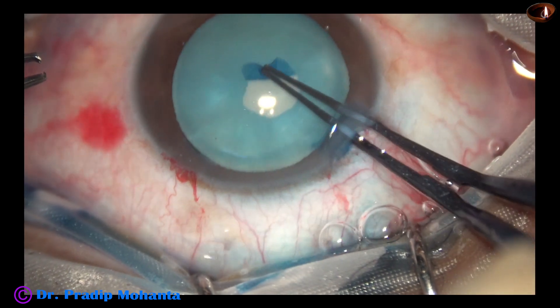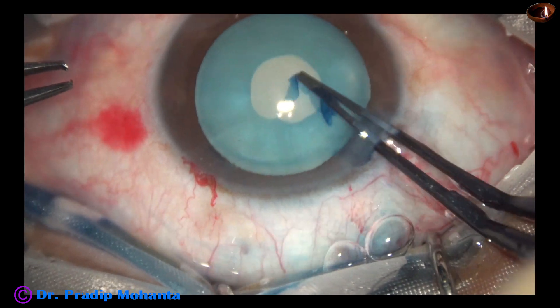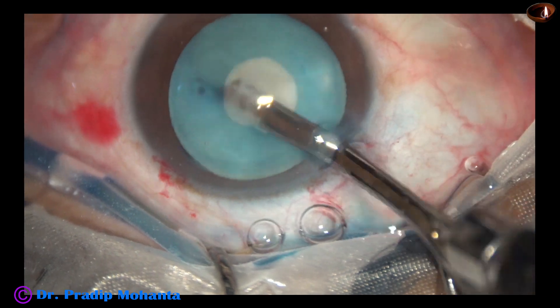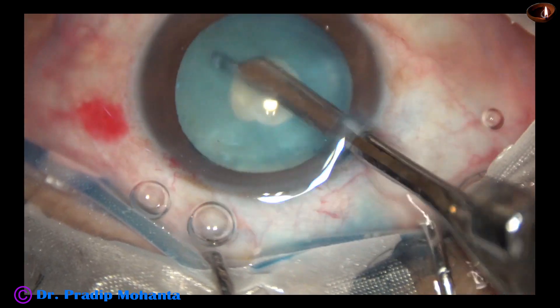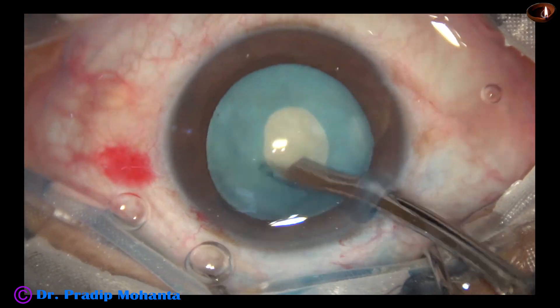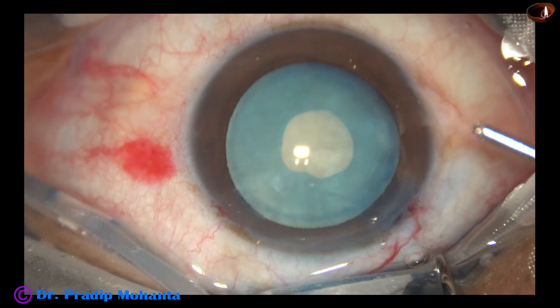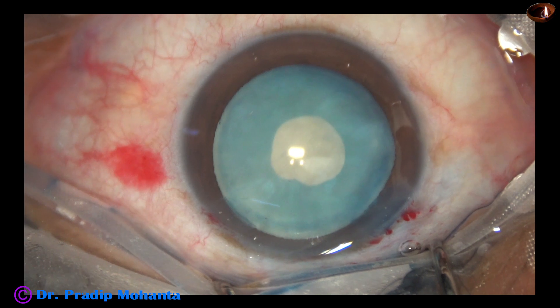A small rhexis is made with the help of Utrata forceps. In this case, there was no leakage of any milky fluid or any oily fluid. Still, there is some convexity of the anterior surface. It is always safer to use a small rhexis to aspirate some lens matter, decrease the intralenticular pressure, and then enlarge the mini-rhexis into an optimum sized one. The viscoelastic is used to fill up the anterior chamber again.